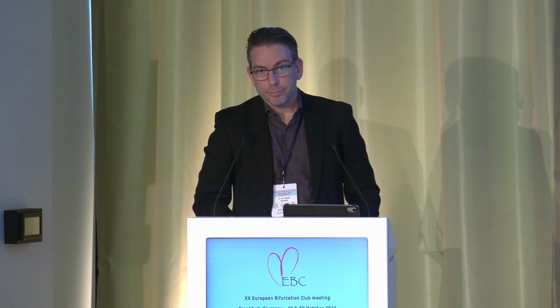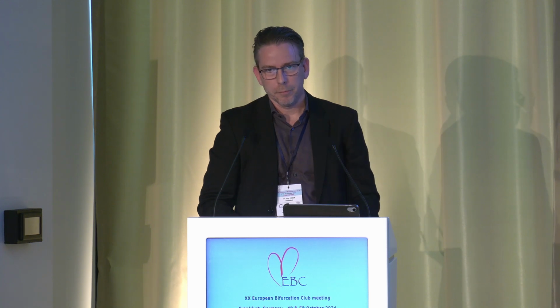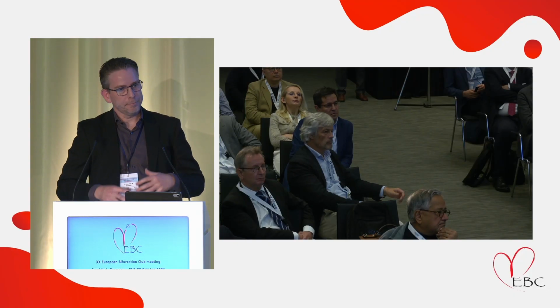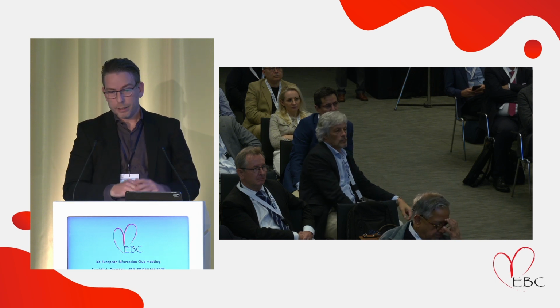Yeah, so on the day of the procedure, we had all kinds of events, but it's of course mainly driven by periprocedural myocardial infarction. But these were by the modified SCAI definition, meaning these are quite considerable myocardial infarctions. So the procedure is probably more predictable if you do it imaging guiding, since you have lower numbers. But we also had catastrophic cases.